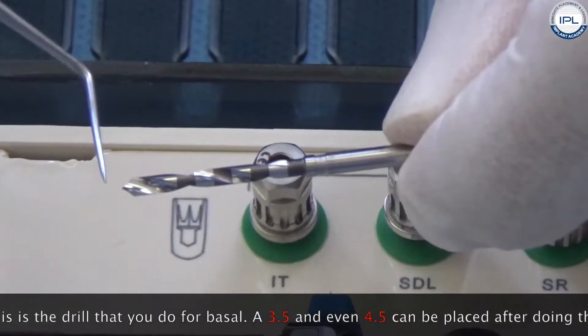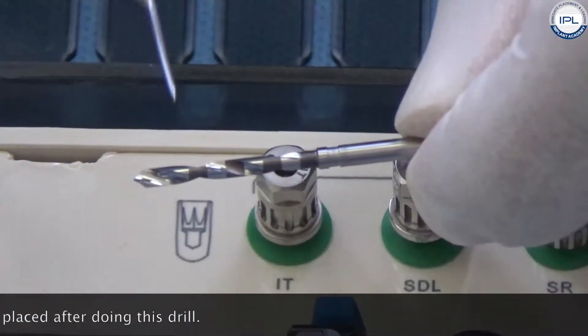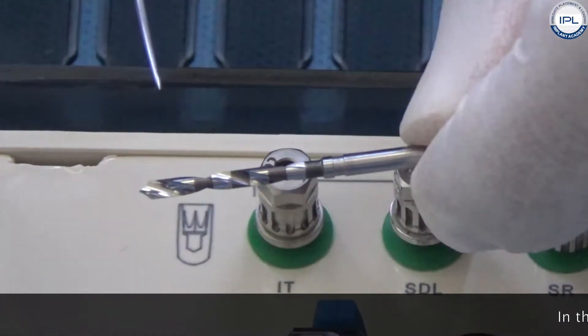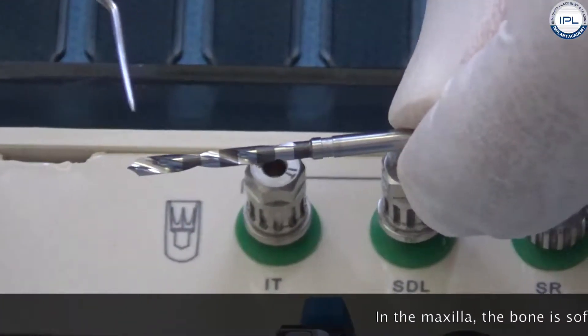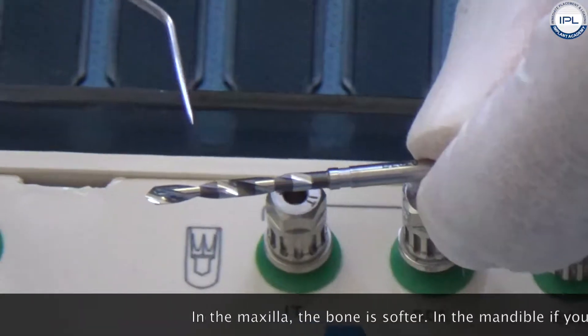3.5 and even 4.5 can be placed after doing this drill. In the maxilla it's much easier, the bone is a lot softer.